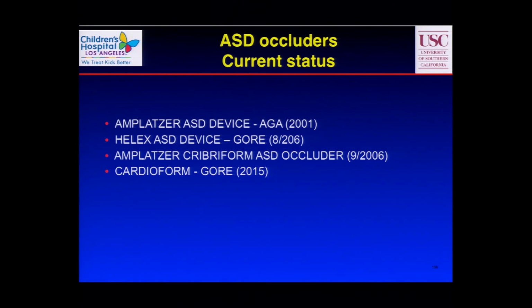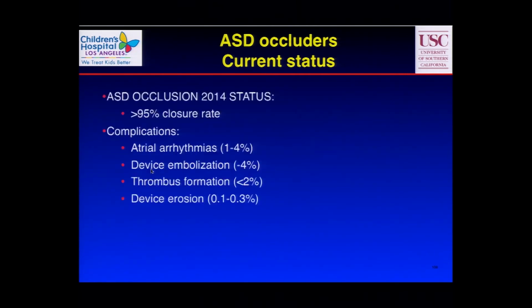The current status is that all these are available, and in fact, in 2015, the Helex device has now evolved to the Cardioform that looks like much more easy to deliver. Unfortunately, I don't have a picture for you this time.